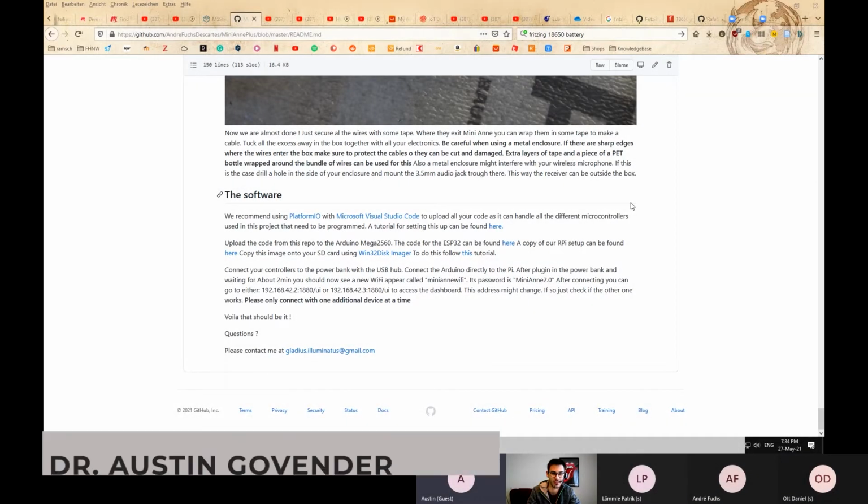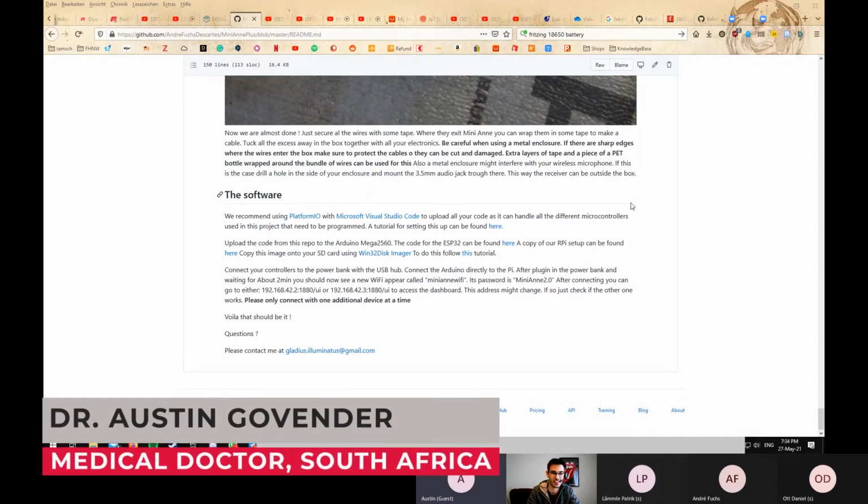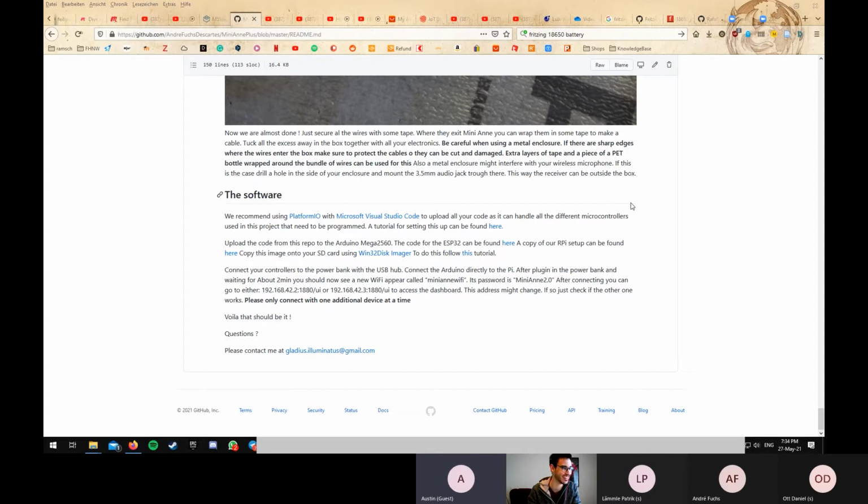Yeah, I must start by saying that is fantastically impressive, guys. It's really amazing. I'm not even gonna lie. Yeah, back here in South Africa, which I'm sure you guys consider a resource-limited country, and I'm sure we do as well. I mean, our CPR dolls are pretty much what you said. It's more of an analog feedback system. And that's the only feedback you're getting. You're pretty much knowing how far you're compressing when you're doing chest compressions. No feedback if you're doing respiration. So you kind of just... Oh, no, sorry. The only feedback on respirations is you're looking for chest rise.